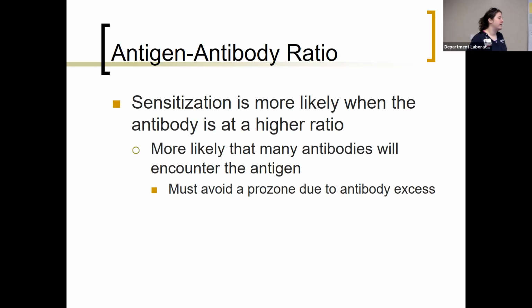If you want to take it to the science, you have your serum to cell ratio. You'll have 2 drops of serum and 1 drop of cells. That really increases the chance of the antigen and antibody coinciding, making that connection for the lattice formation, the agglutination.